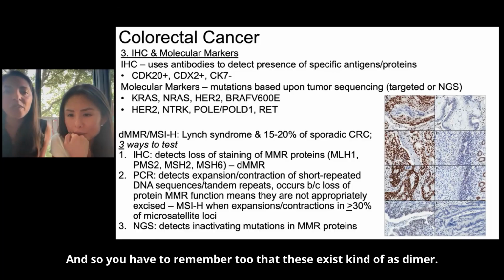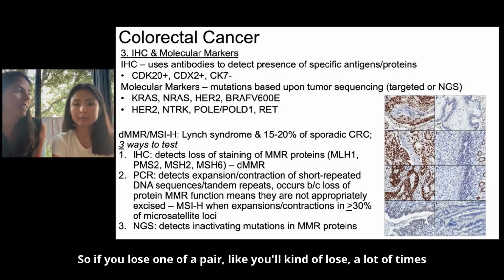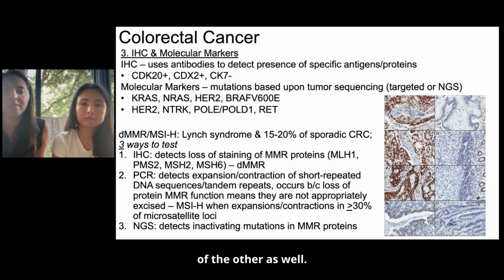Exactly, yeah. Got it. And you have to remember too that these exist as dimers. So if you lose one of a pair, a lot of times you'll lose staining of the other as well.